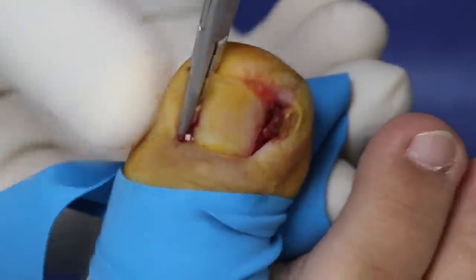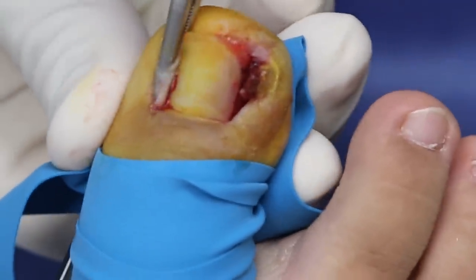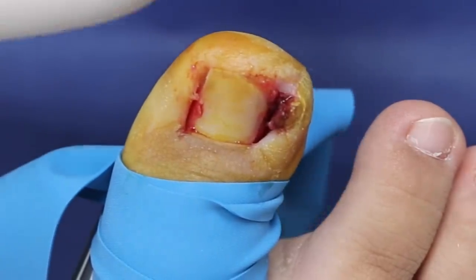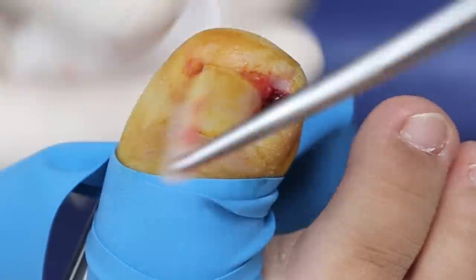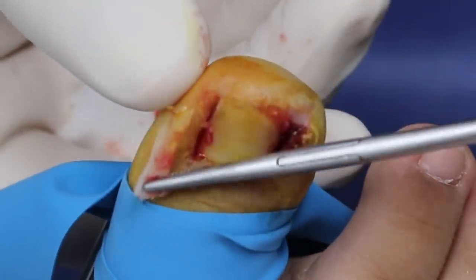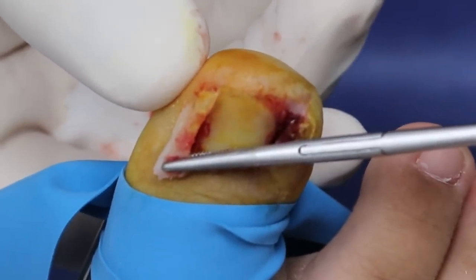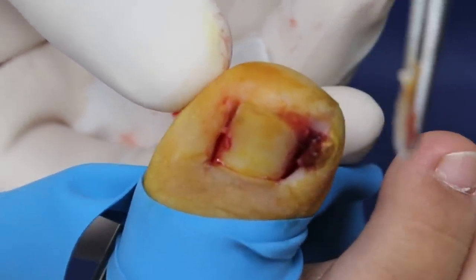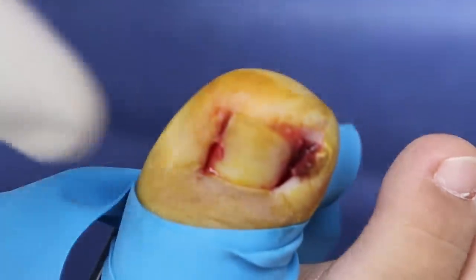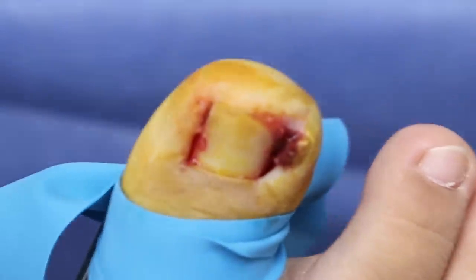I'm going to do the same thing on this side. Again, very small hole. And we'll see in the video how wide that piece is — it goes very wide. Look at that. So the hole isn't big but the nail is just so wide, and going down.